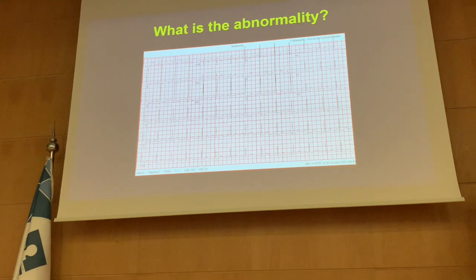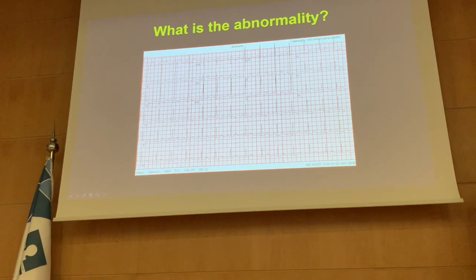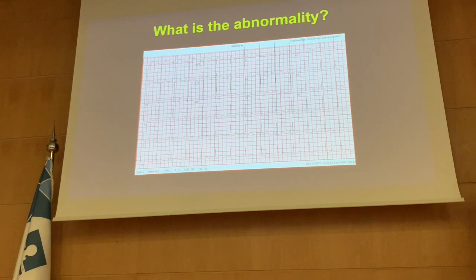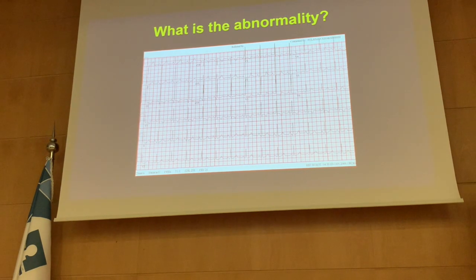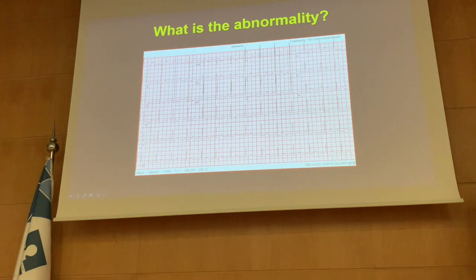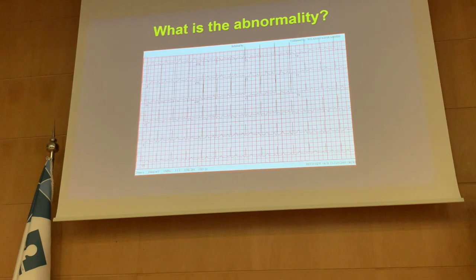Only this? No. Right ventricular hypertrophy, and WPW, and Duchenne muscular dystrophy. Those are the differential diagnoses of a big or positive R in V1. I stressed those in the first lecture. It seems you forgot them. Whatever. If you have a positive R in V1, it cannot be anything except one of those differential diagnoses. Believe me, however they twist the question, one of them will come up.